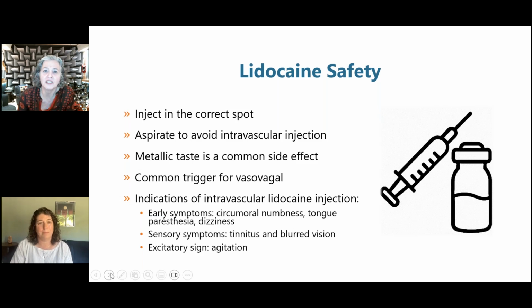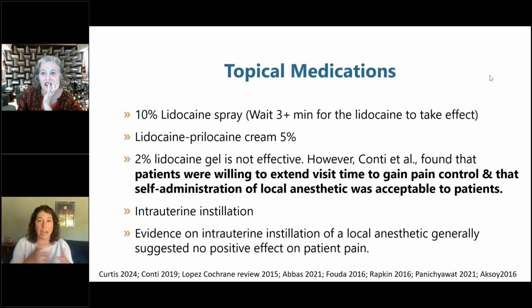More on this, Jolie? No, just if you were concerned that you had injected intravascularly, that would be a more emergent situation to attend to. But that's why you're going to aspirate, and if you're aspirating and you don't draw blood, the likelihood that you're in a vessel is quite low.